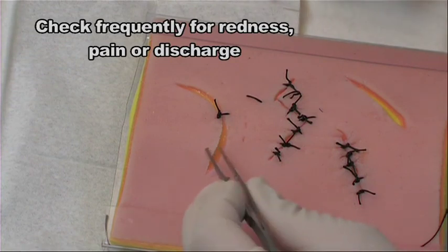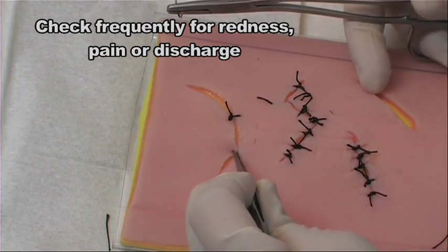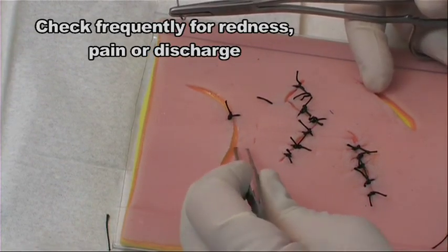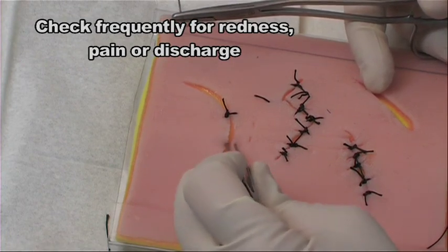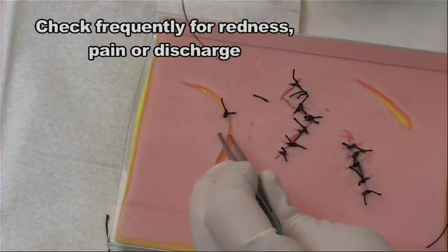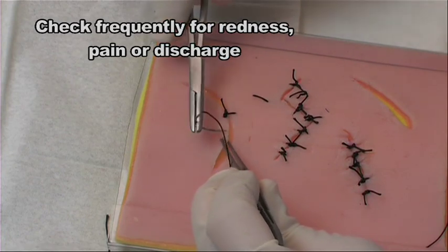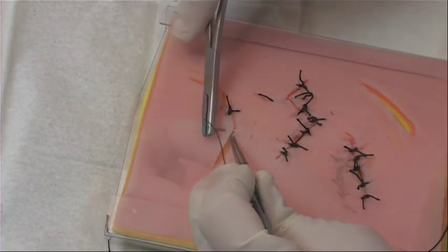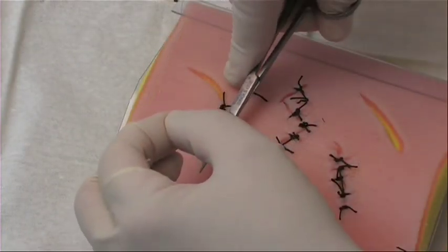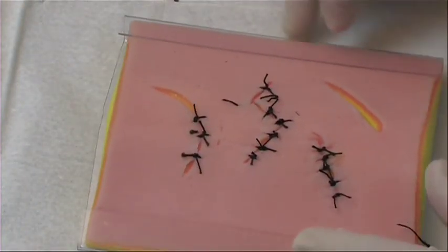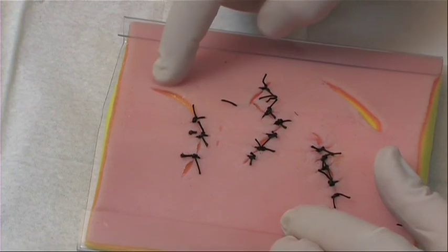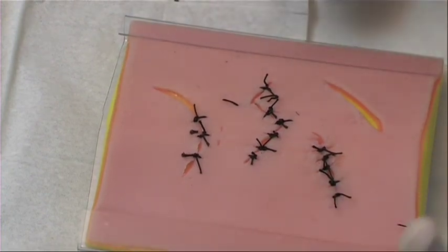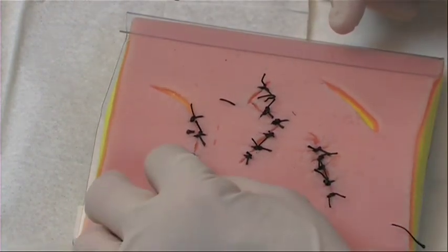And then I can either half them again and that might be all that you need, in which case you only need three or four. Or you can just move because it's now easy to find which parts can belong to which parts. So then you would do the same thing on this part here, maybe putting two, maximum three different ones on it.